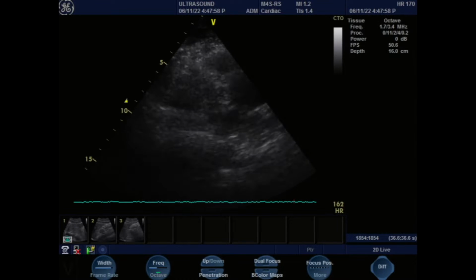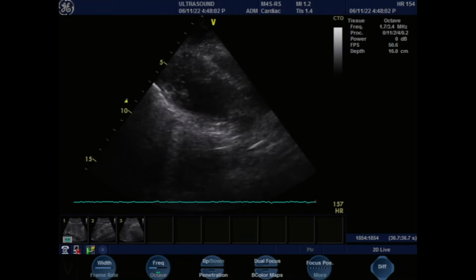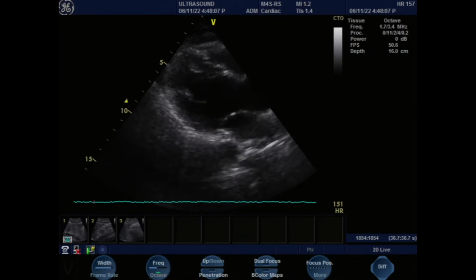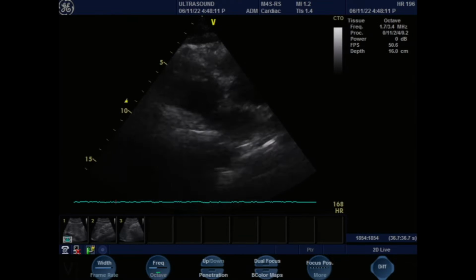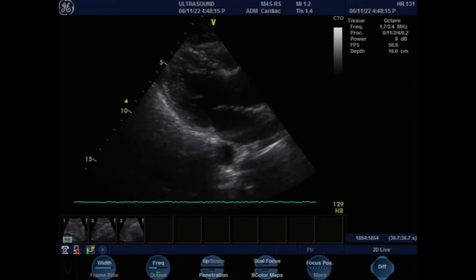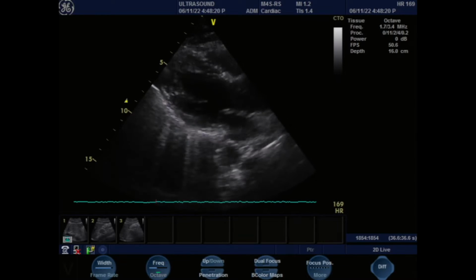So here, this is the aortic valve right here. This is the aorta you're seeing. Over here, this is the left ventricle. This is part of the right ventricle, which is cut off. We're not seeing the full right ventricle. So we're seeing a left ventricle here, and he's got a good normal, at least in this view, you can see the heart is beating nicely. You don't have to know what the ejection fraction is, but most people can tell that his heart is squeezing normally.